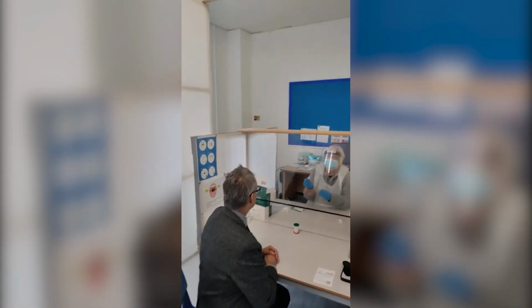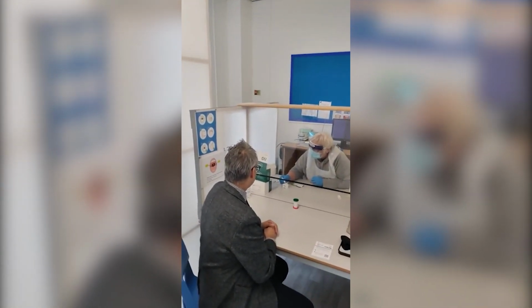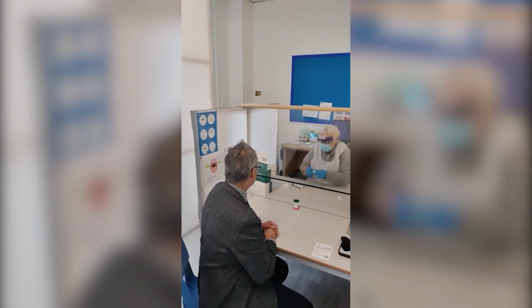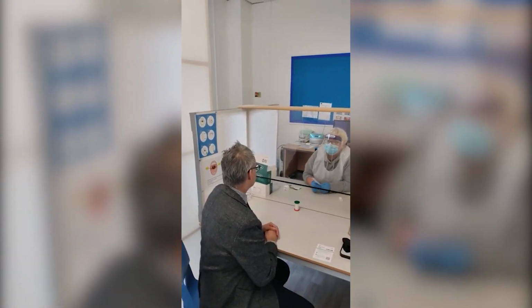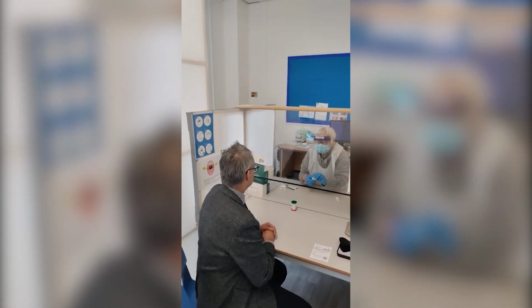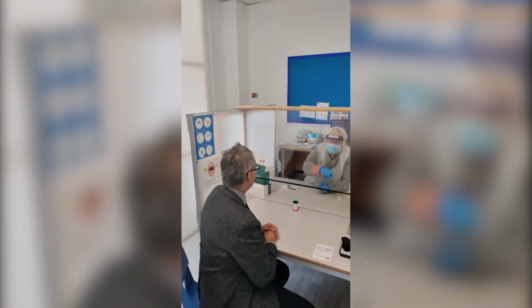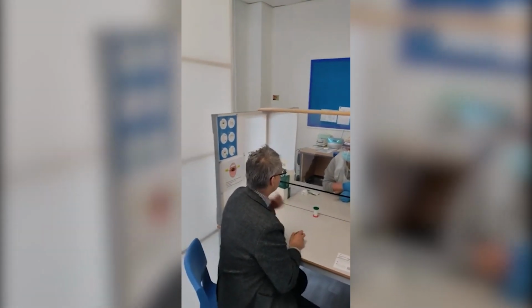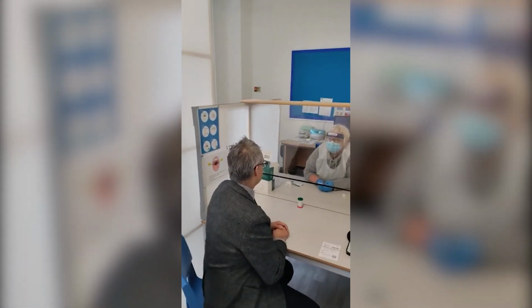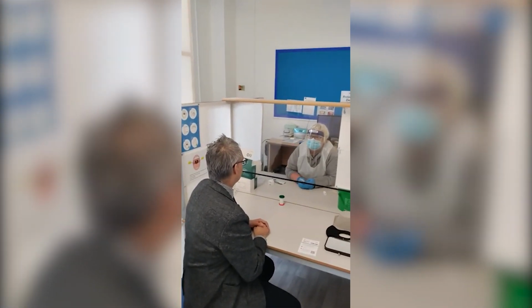So this is an extraction fluid that we use, so I'll just put 6 drops in there. And in a second, I'm going to give you your swab to use, but I'll just explain to you how you use it first. So I'll hold it at that end. Always hold it on the plastic end, don't hold the fabric end. You've got a mirror there to help you. And you do 5 times on one tonsil, 5 times on the other tonsil, and then 10 times up your nose. Okay, just choose whichever side. Don't push it up too far, just to get a bit of resistance.